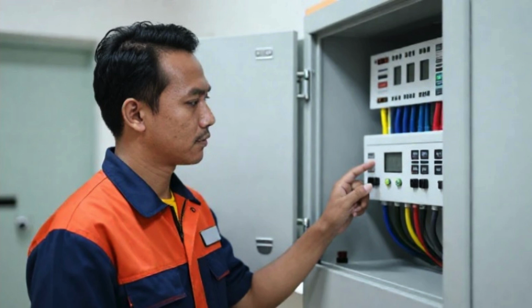Medical equipment is also classified according to its level of protection against electric shock. For example, devices may be classified as Class 1 or Class 2 equipment. Class 1 equipment relies on protective grounding, while Class 2 equipment uses double or reinforced insulation. Understanding these classifications is essential for electromedical technicians when installing and maintaining equipment.